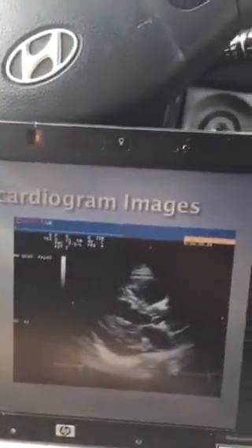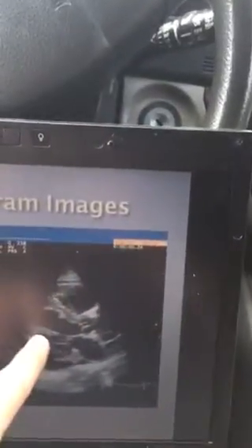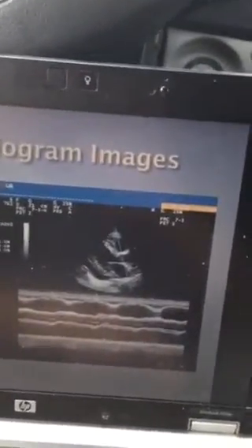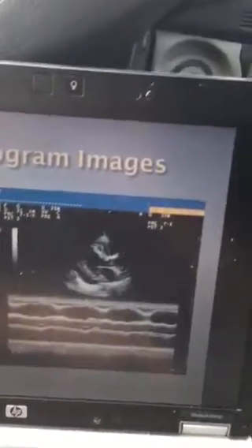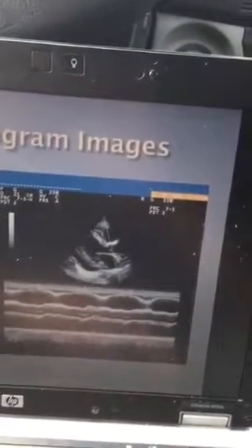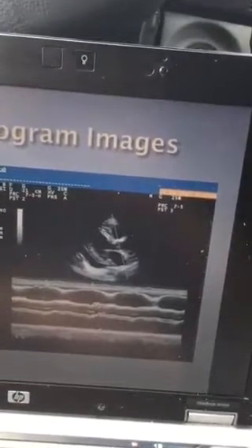But our initial observations from the parasternal long axis, we can see the pericardial effusion way down here. We can see left ventricular hypertrophy from having to work a little harder, and we can see an enlarged left atrium. And again, the enlarged left atrium, yep, large.